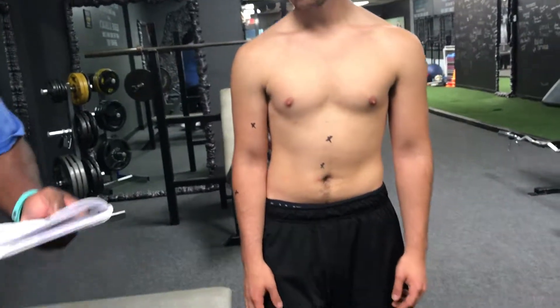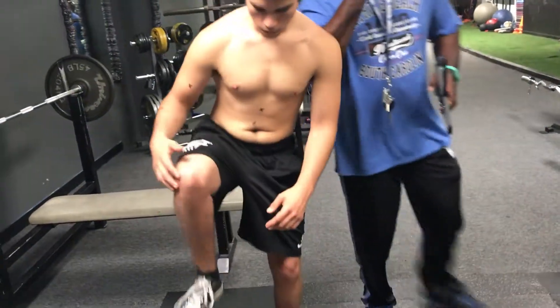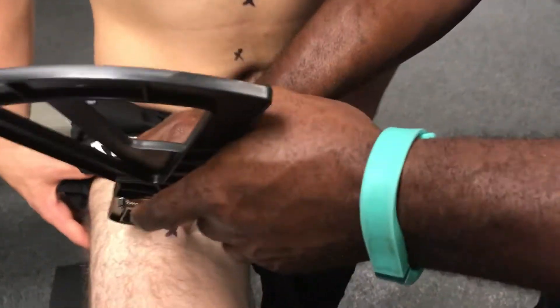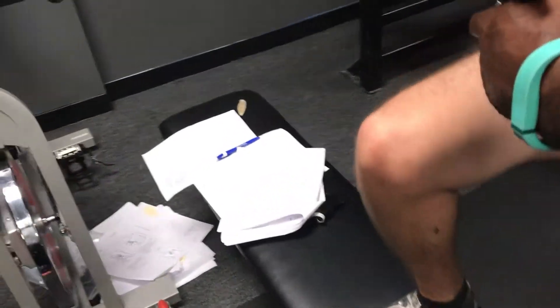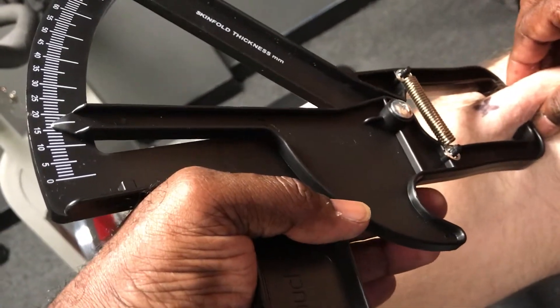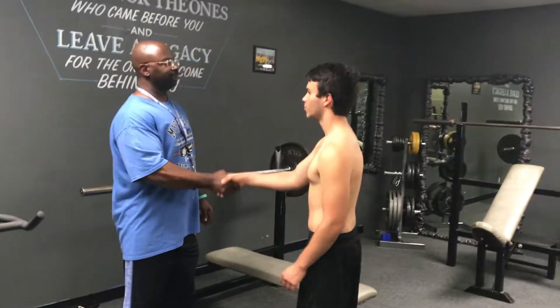Last one is your thigh. We're going to do it at the midline of the thigh. Go ahead and put your leg up here. First reading is 15, second reading is 16. Alright, thanks a lot man, I really appreciate it.